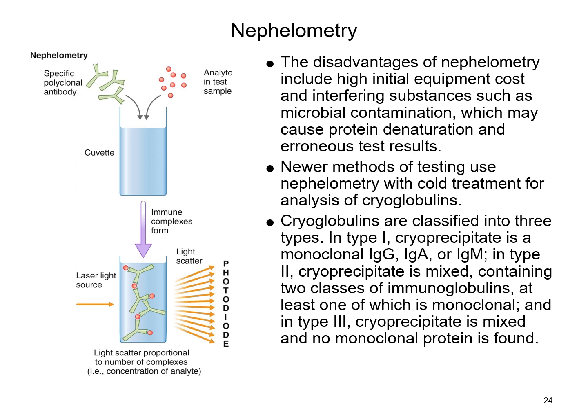The newer methods actually allow for testing with a cold treatment that will look for and analyze cryoglobulins. Cryoglobulins are proteins that will precipitate or gel when they're exposed to colder temperatures, but they can be dissolved when they're heated. One of the phenomena that you might recognize is Raynaud's phenomenon, where people will get that bluish to white discoloration in their fingertips and finger pads. It has to do with those cryoglobulins within the patient. The temperature in the extremities isn't as well maintained, so you can see the visual appearance of that taking place.